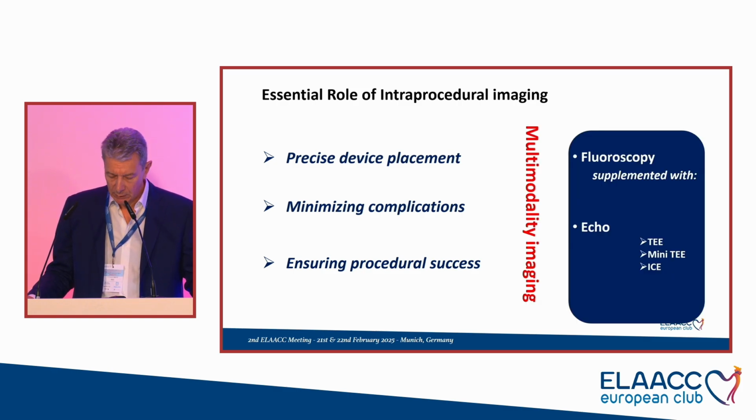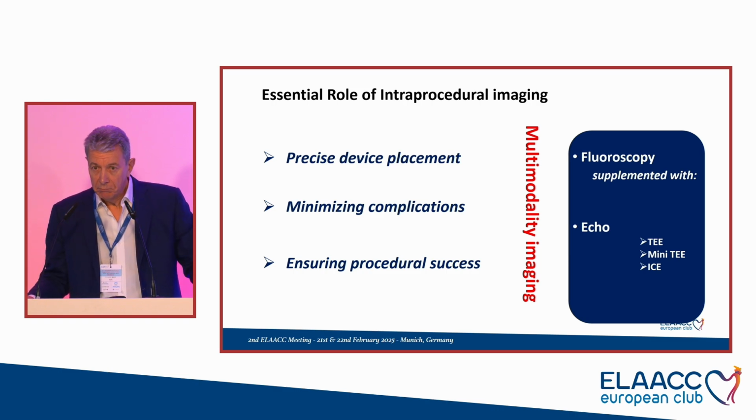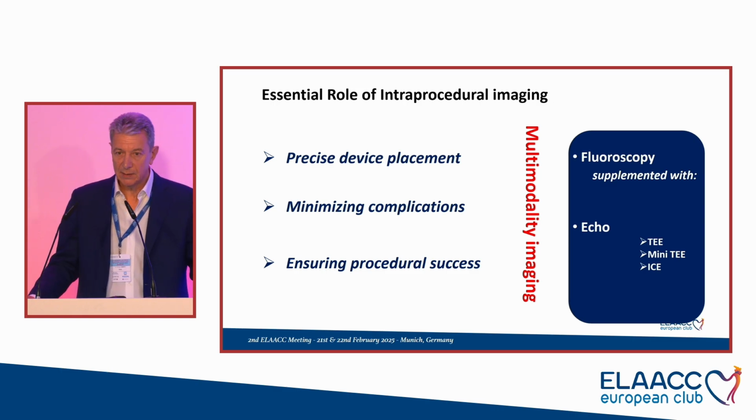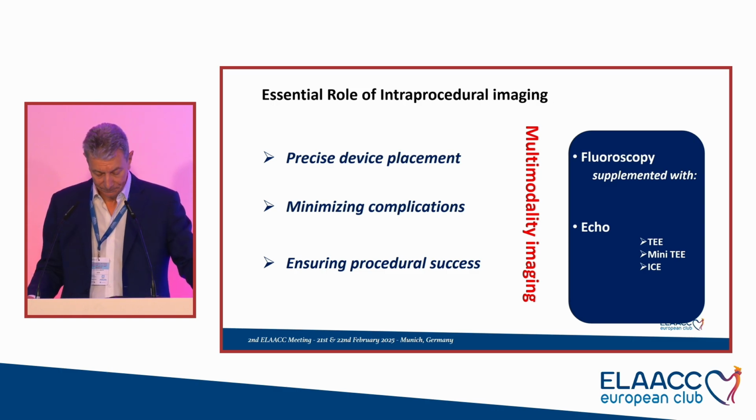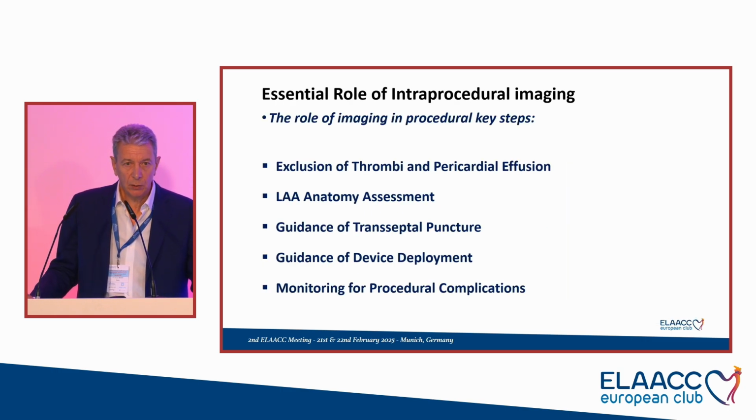The procedure is, in general, based on multi-imaging modality. In the general practice, the fluoroscopy is the base, supplemented with the echo in different kinds of modality, TE, mini TE, or ICE. In my personal view, it is exactly the opposite. It's echo-based and supplemented by the fluoro. But the point is what we ask of the imaging for a perfect procedure.